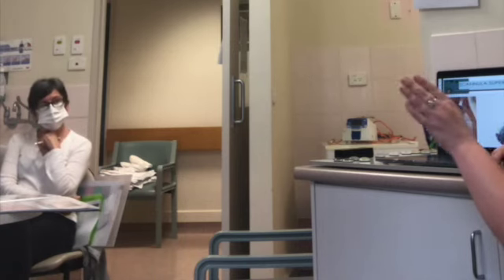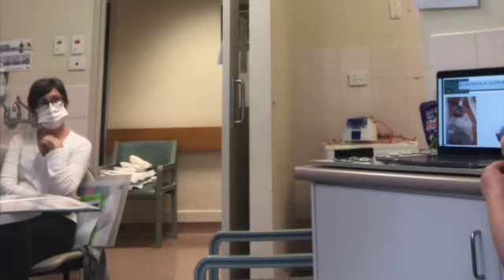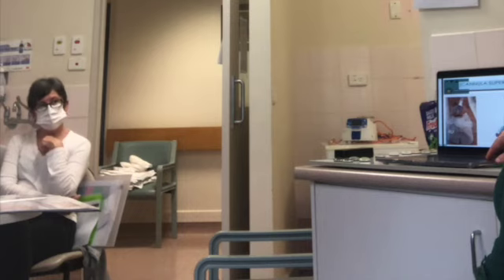Kids are very specific about what we have to do and how we do it. There's a lot of staff that say, oh, it's policy. Your ID should have that, so it must be a rumour if it isn't. I've done a bloody good read of that policy. Anyway, if you have a takeaway point for today, I'm just curious about the extension line. Can you please just change the dressing and not stick another bit of tape on it? And we'll have a go at that. I know we're not very good at it. I know nobody has time to do anything anymore. But if this was your nan.